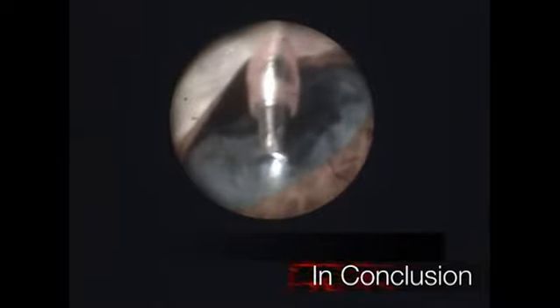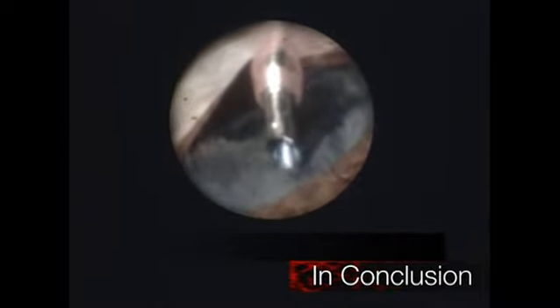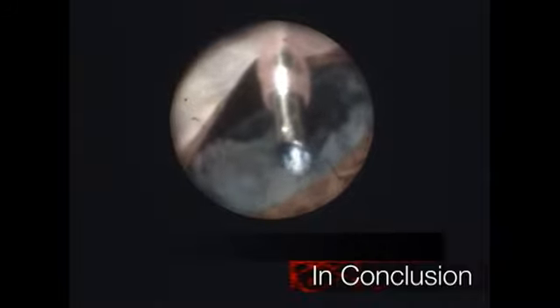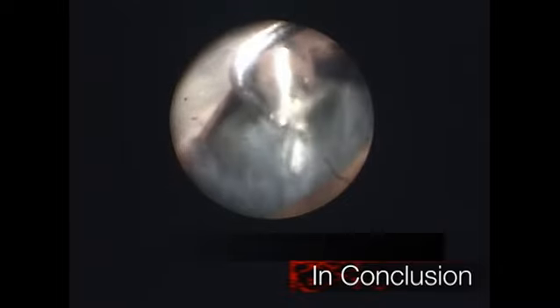In conclusion, endoscopic images can assist in cataract surgery, not only by providing lessons, but also by enhancing diagnostics and treatment.